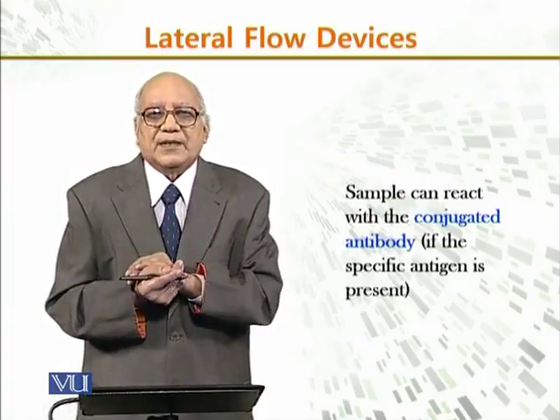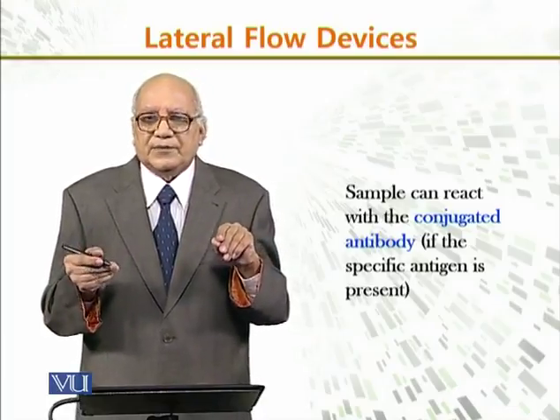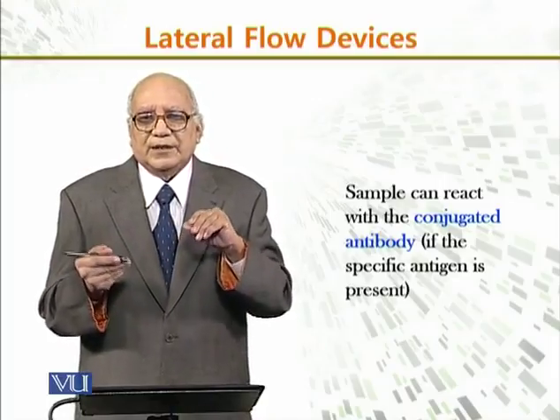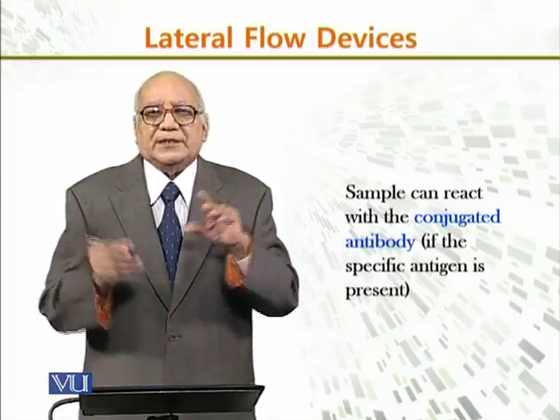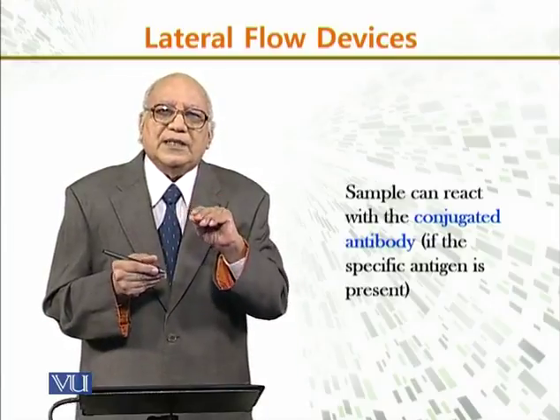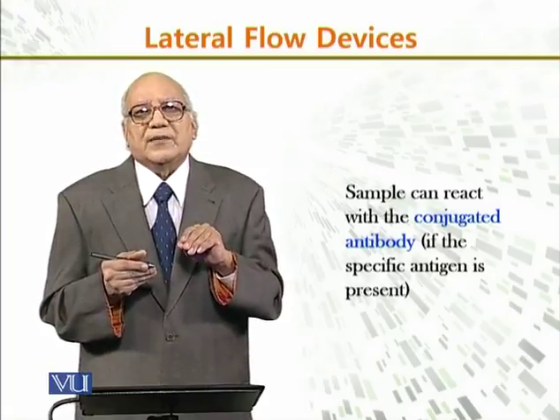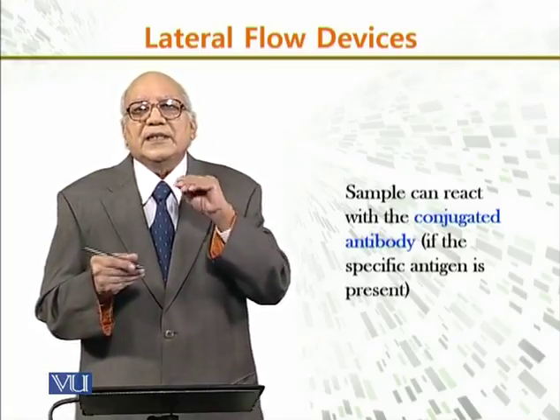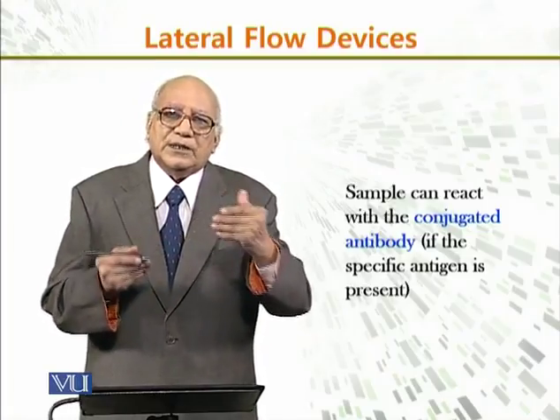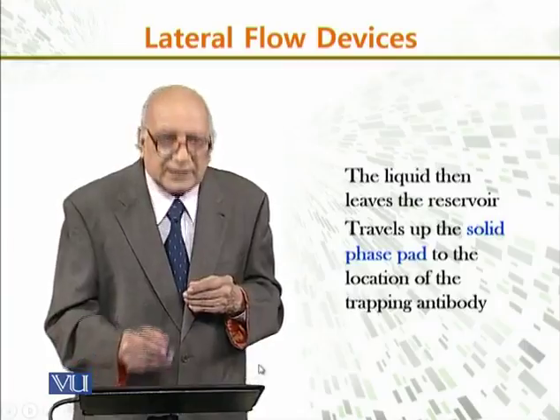Now, the sample can react with the conjugated antibody and the specific antigen which is present. The sample will react with the conjugated antibody only if the specific antigen is present. If the specific antigen is present in our sample, then it will react with the conjugated antibody, otherwise not. That is the major principle.